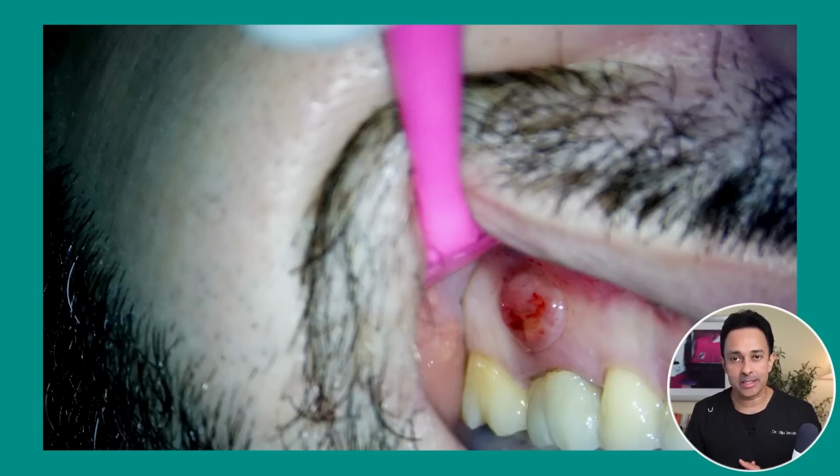So what the general dentist did was put the crown back, and as luck would have it, 2 weeks later, after cementing the crown back with a very strong resin cement, the patient came back again with acute pain. And then what we found was something like this, where there was a small bubble on the buccal surface and the patient was in discomfort. And this crown was recently cemented, so it was pretty strong. So we didn't want to remove the crown.